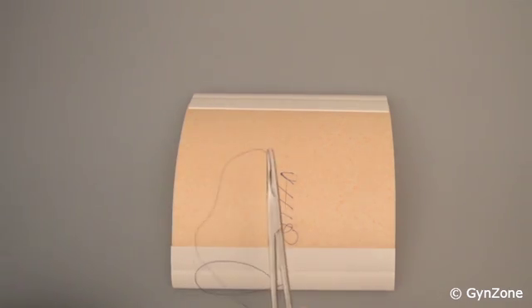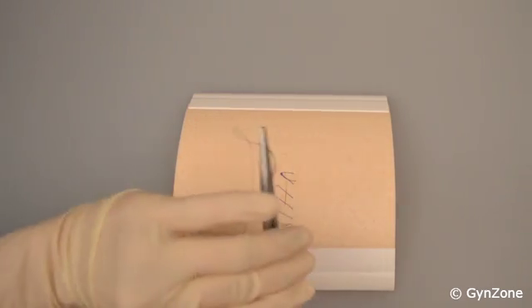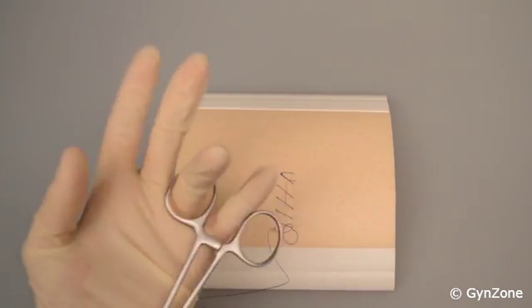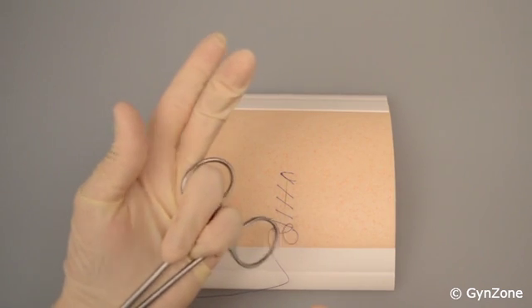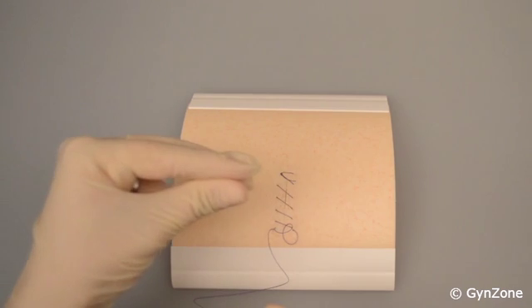Put down the dissecting forceps so you can grip the needle holder with the non-dominant hand. By holding the needle holder towards the palm of the hand, you will allow free movement of your thumb, index and middle fingers to work with the thread.